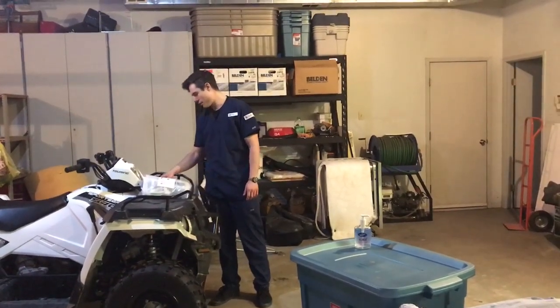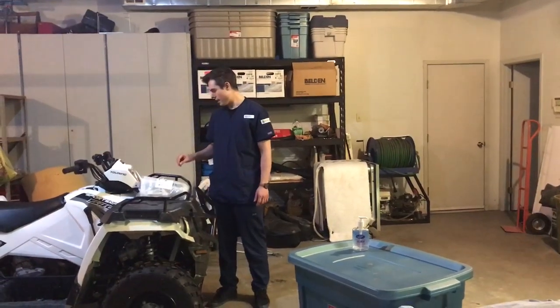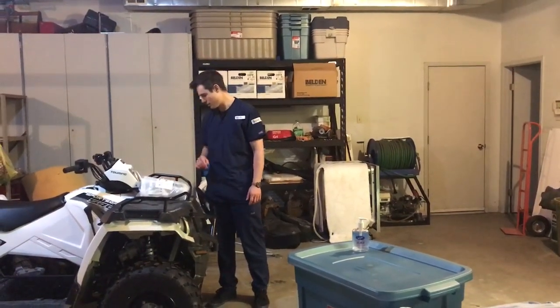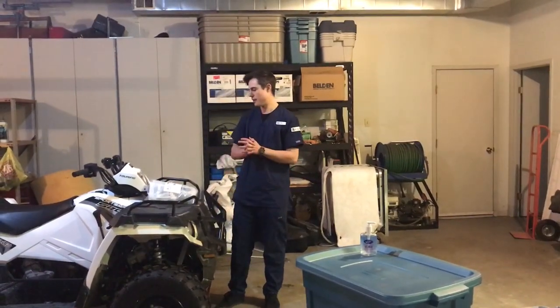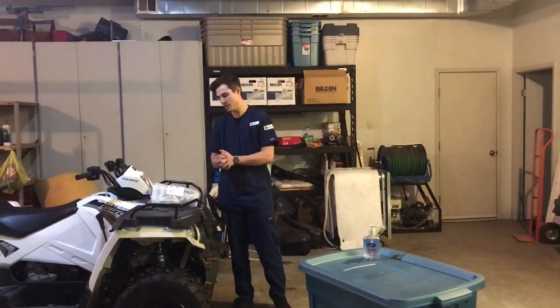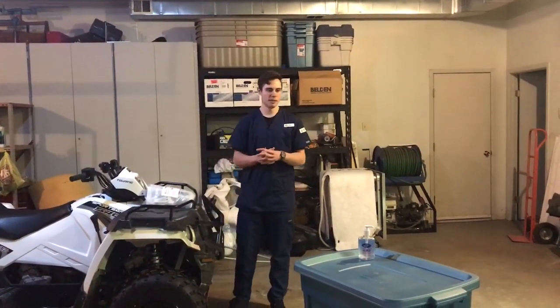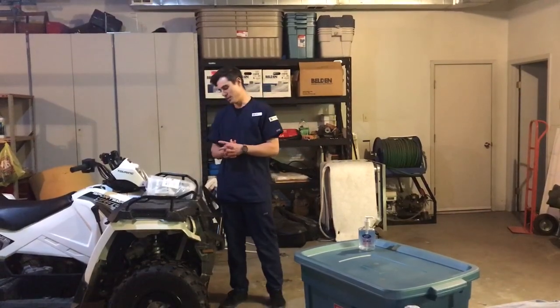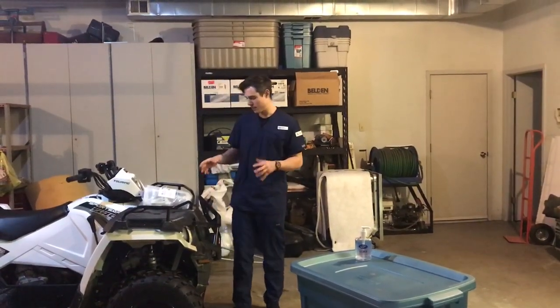So we have for nursing Jake, date of birth January 1st, 1960, and our patient has no known allergies, so it is appropriate to do that. Now I'm going to clean my hands, and I'm going to verbalize that pericare has been done prior to this procedure. So I clean my hands and collect my supplies from my clean supply room.